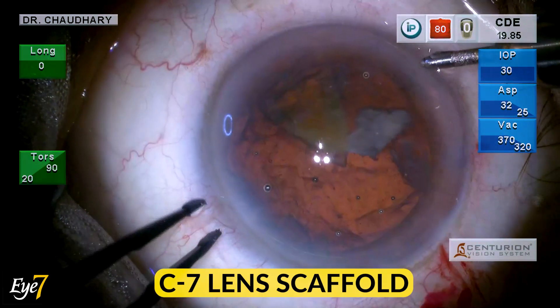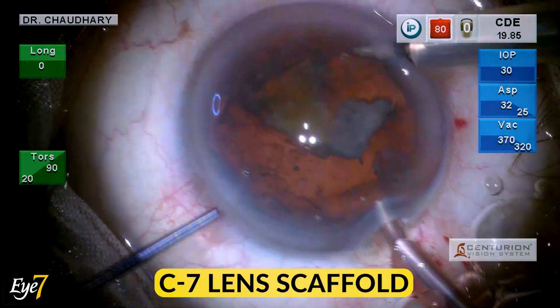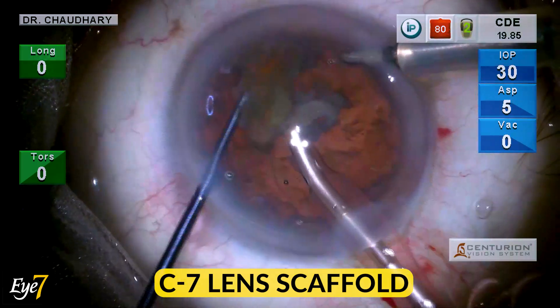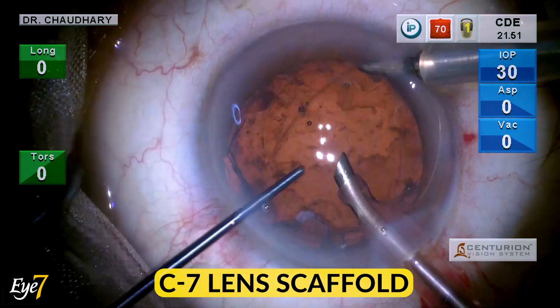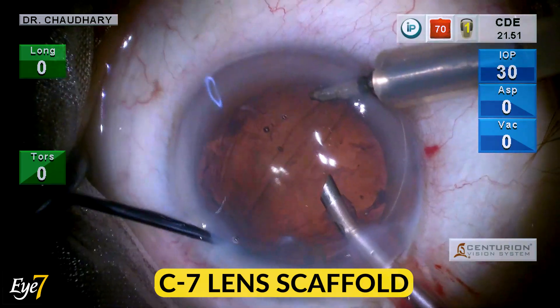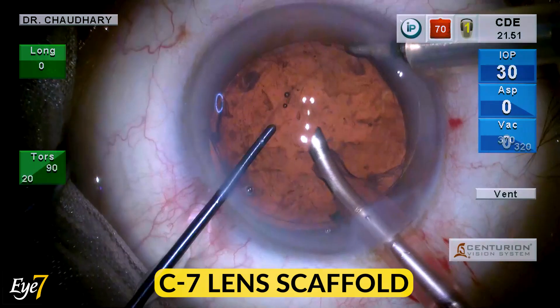An anterior chamber maintainer maintains the IOP at 30 at all times. Now with routine phaco under low IOP conditions, the nuclear pieces are comfortably removed without any fear of the debris falling into the vitreous. Some epinuclear material or thick cortical material can also be guided over the trough of this lens scaffold and removed.